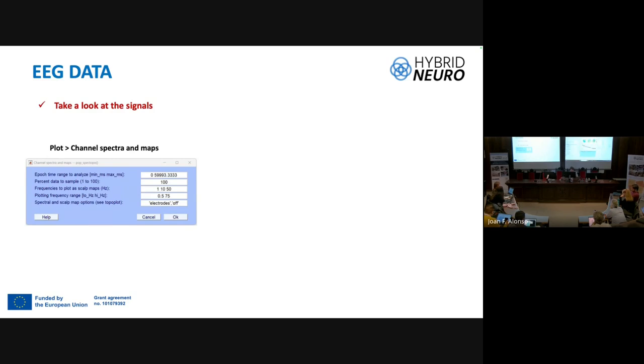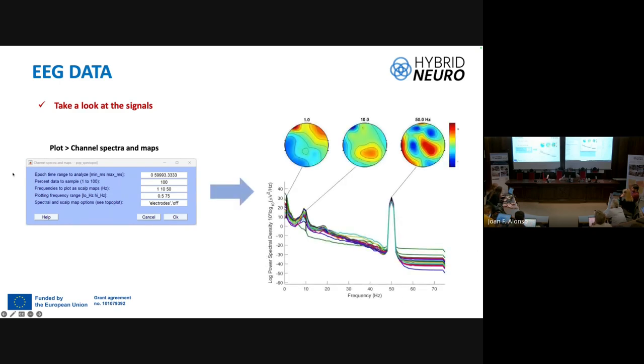And we can see here in the spectra the prominent peak at 50 hertz, confirming the high contamination from the power line interference. Similarly, the spectra at the low frequency, 1 hertz, indicates the presence of possible ocular contamination because it's very anterior, okay? And finally, we can also see the posterior localization of the alpha activity, which is characteristic of closed eyes, as I commented. Okay.